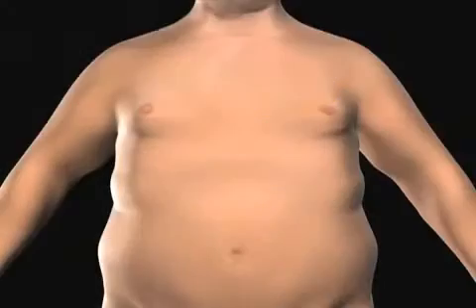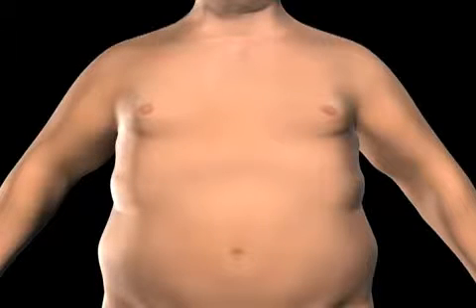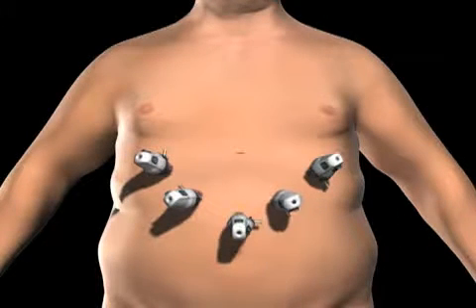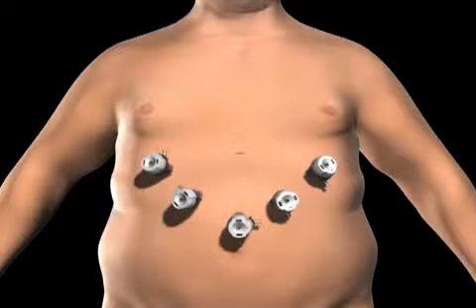To gain access to the abdominal cavity, small incisions are created on the abdomen. Trocars, which serve as passageways for the surgical instruments, are placed into the incisions. Surgical instruments are passed through the trocars to access the abdominal cavity.